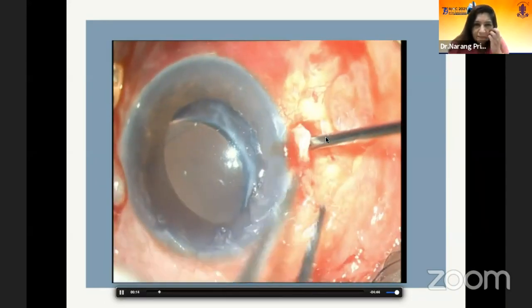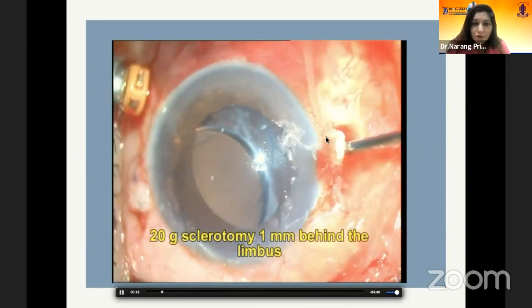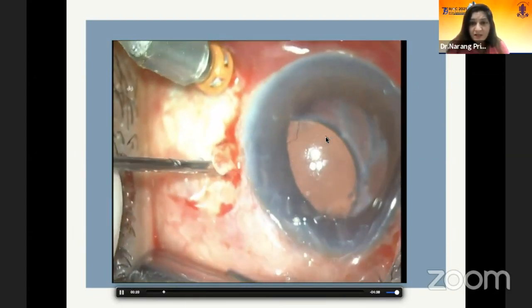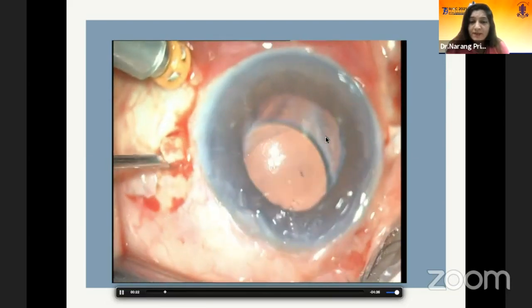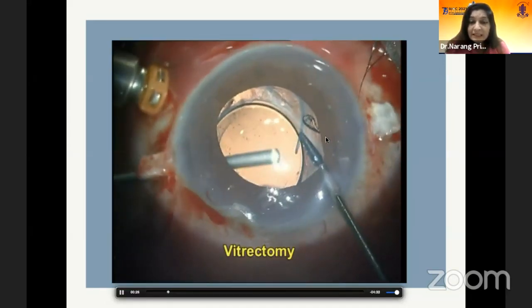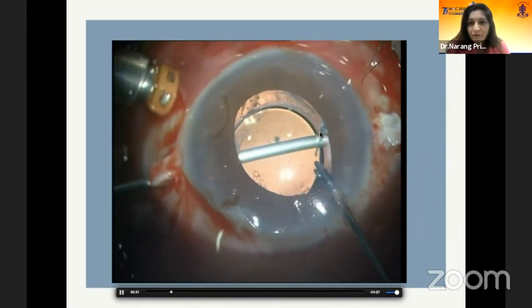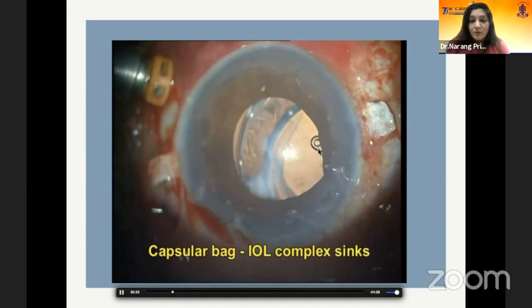This video I have presented in the ASCRS Challenging Case Symposium. This has an endocapsular ring. It has an endocapsular segment. There is a 3-piece intraocular lens also in this bag. Actually, what probably happened in this case was that the suture of the endocapsular segment has gone off. So probably this has come off anteriorly and it no more supports the capsular bag.